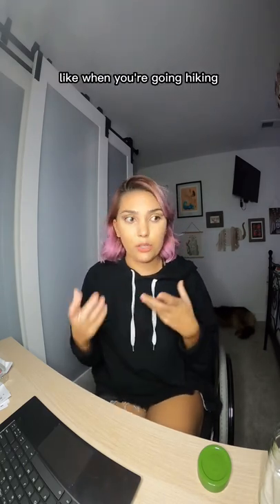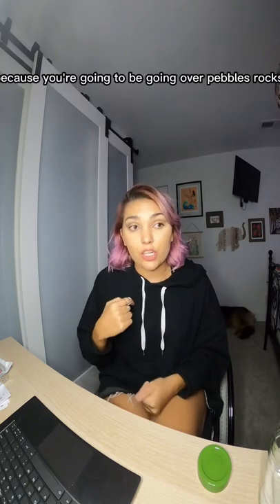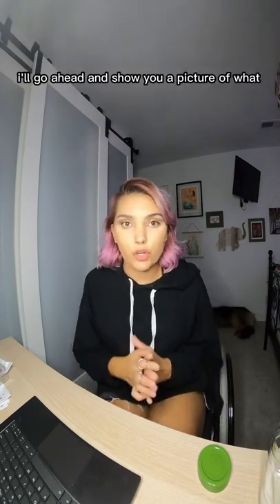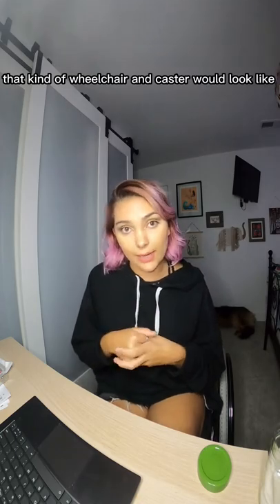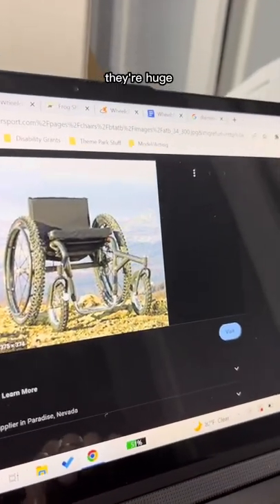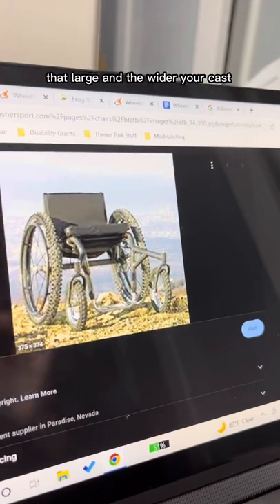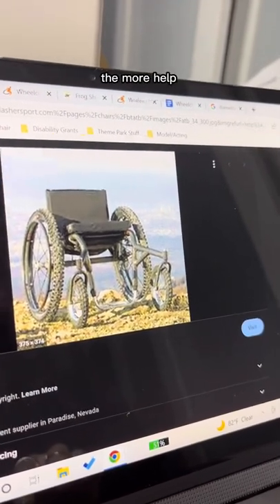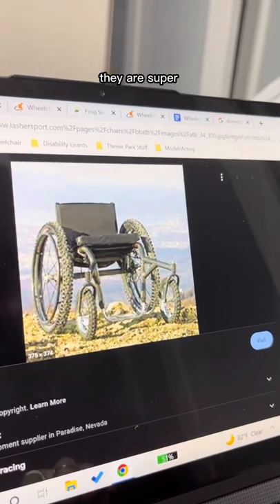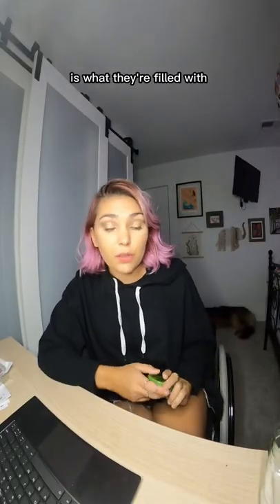That's why all-terrain wheelchairs for hiking or the beach have a very tall diameter — you're going over pebbles, rocks, and all sorts of stuff, so a taller caster helps you get over things more easily. I'll show you a picture of what that looks like. Here's an example of an all-terrain wheelchair — those are probably 12-inch casters, they're huge. They wouldn't be useful in everyday life, but for all-terrain use they can get you over rocks and pebbles easily.